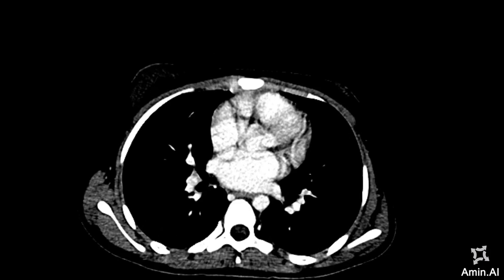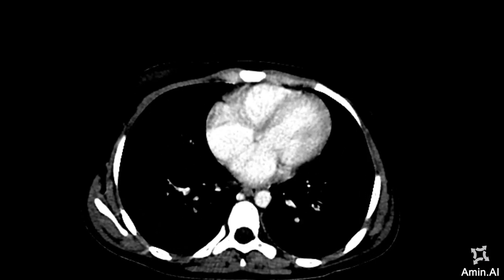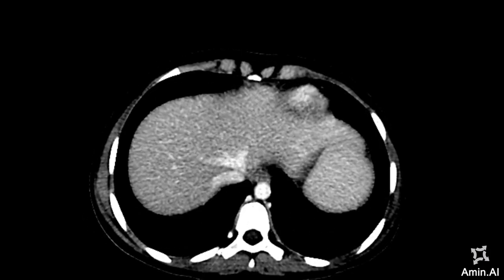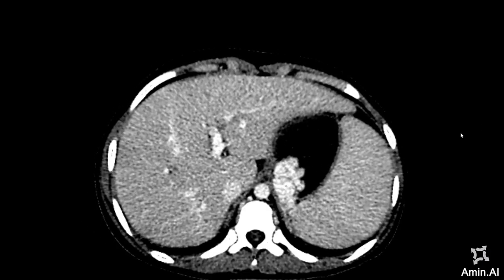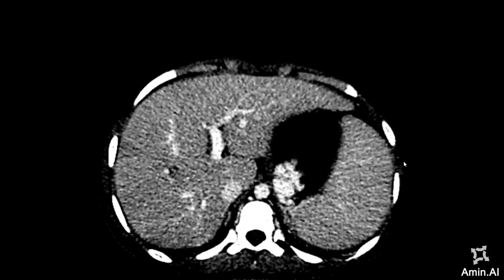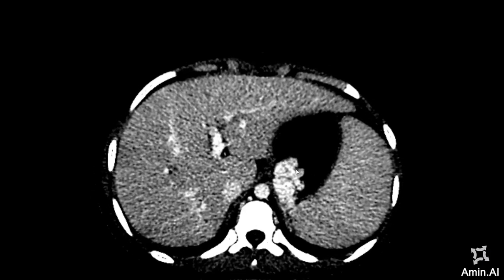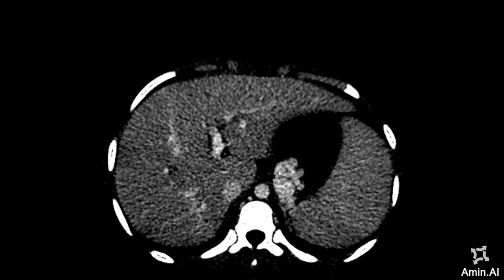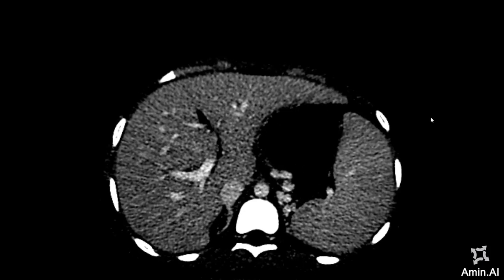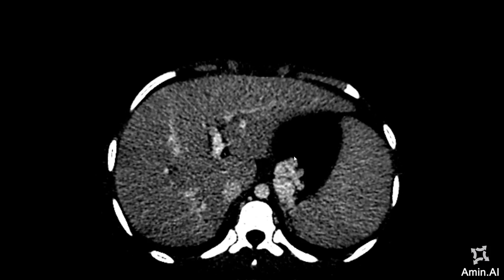As I go to the portal venous phase, you can see that there is a very avid enhancement of the lesion, which is almost following the same contrast signals as seen in the portal venous system. This is the portal vein and this region is that of the lesion.